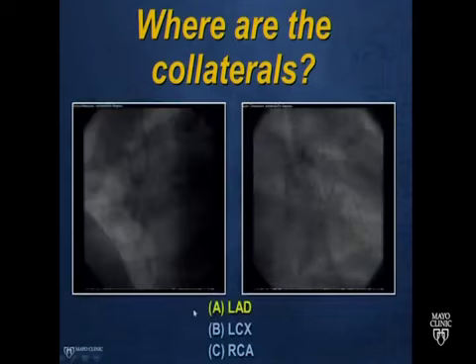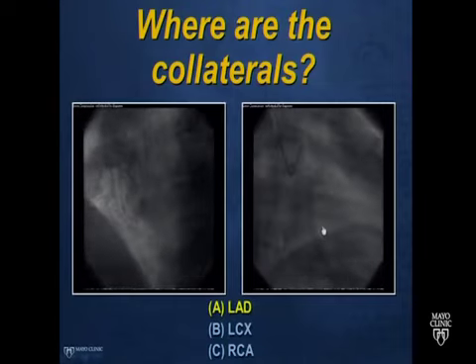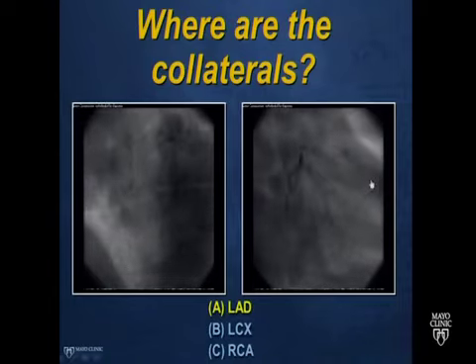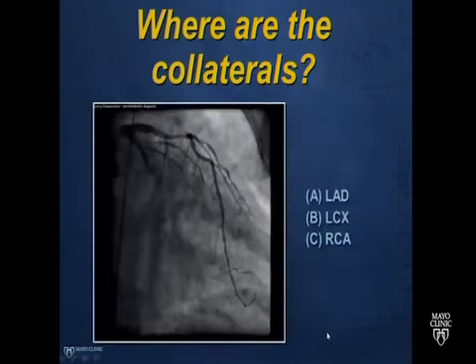And here's a live video. So you may get videos, you may get stills. I think it's probably a little bit easier to see with the video here. And again, look at that movement. Look at the movement here of the LAD. You can see when it pans over, it's beating down with each movement. Very little doubt that's the LAD here. How about here? Are there collaterals here, and where would you see them?